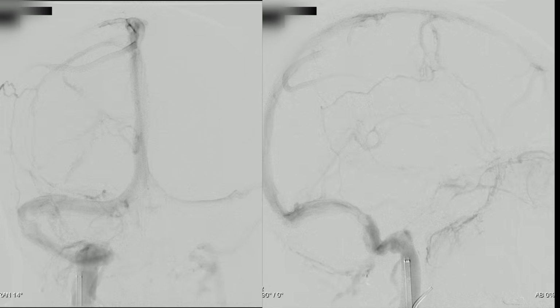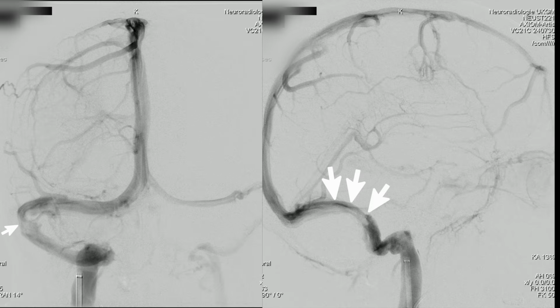And now we need a 2D angiogram to see the stenosis, and as you can see, there is a high-grade stenosis of the right sigmoid sinus marked with the white cursor, and we can see the old thrombus in the lower side of the sinus.